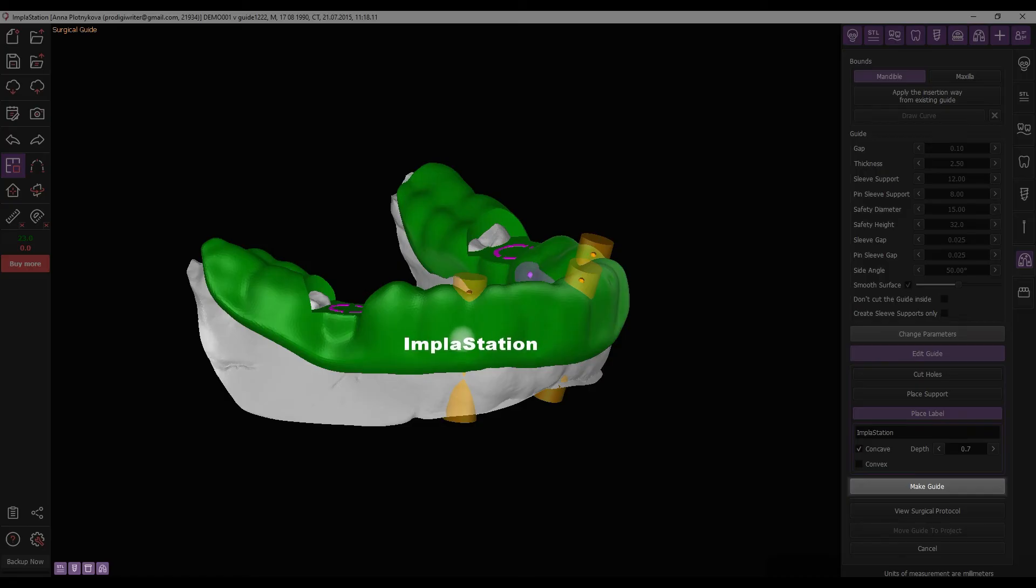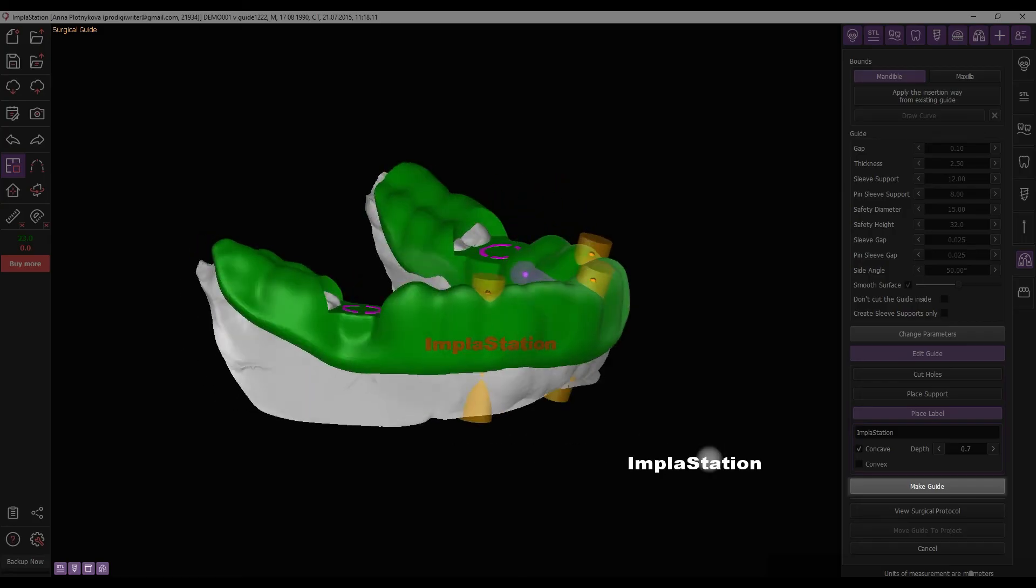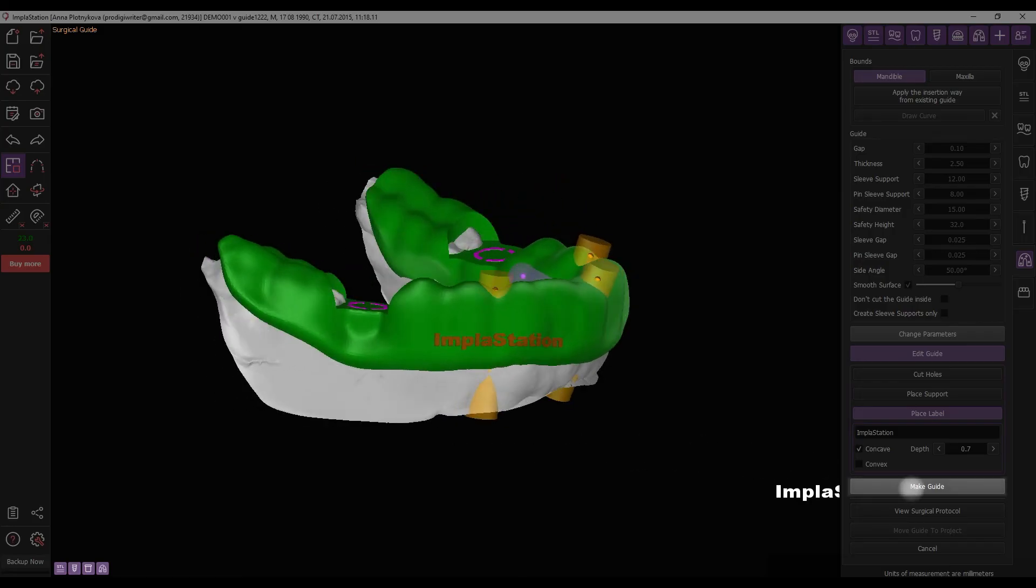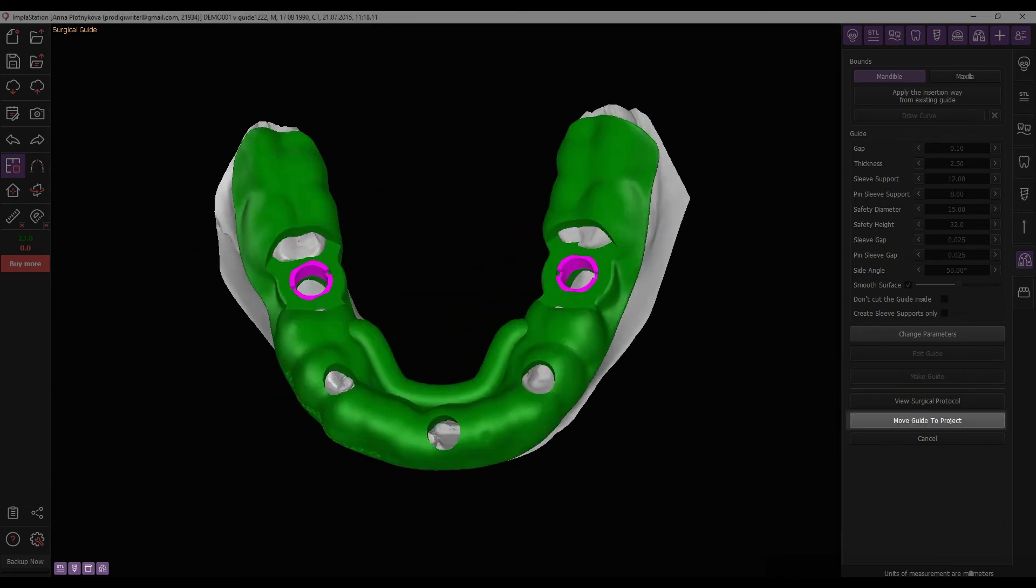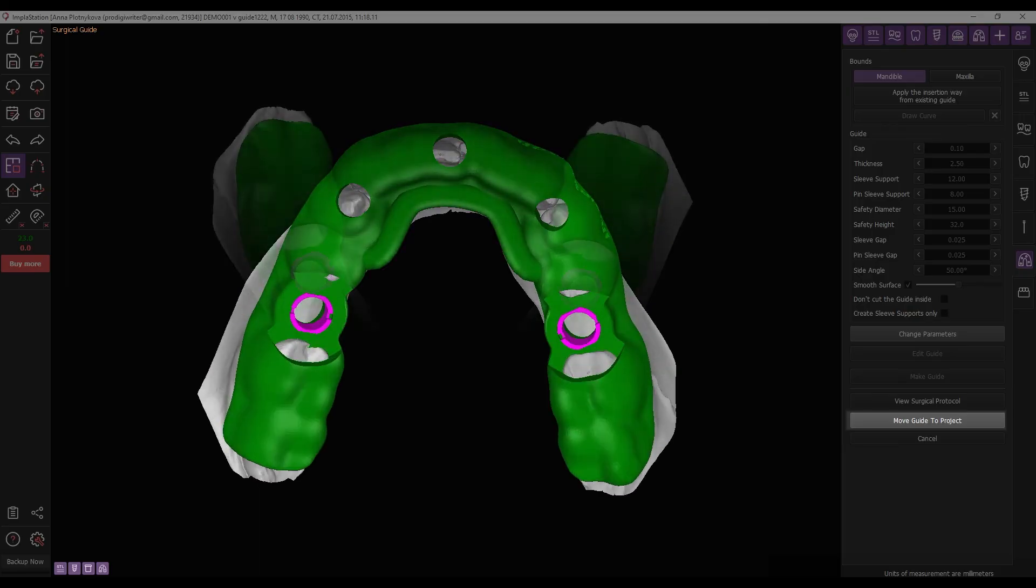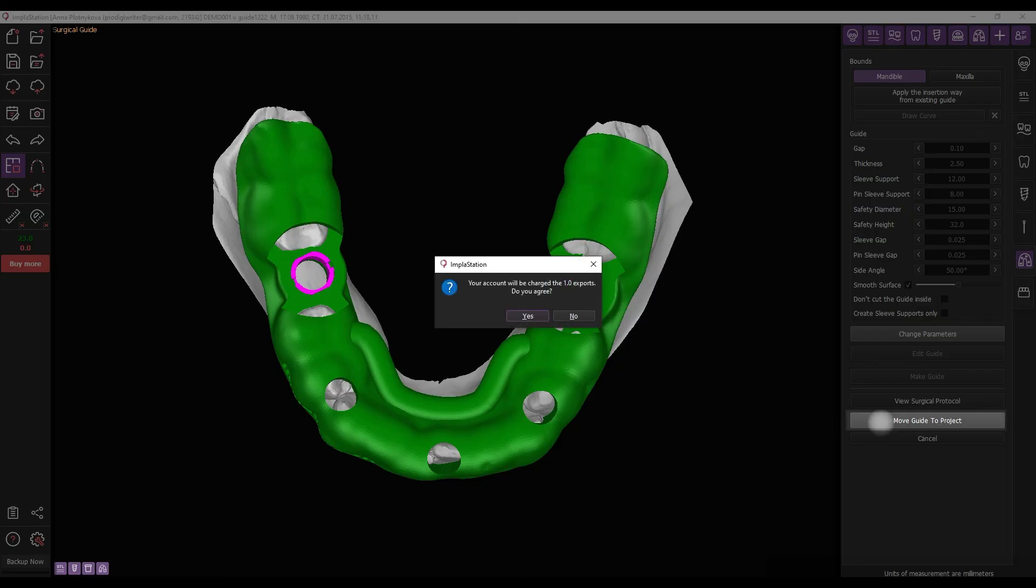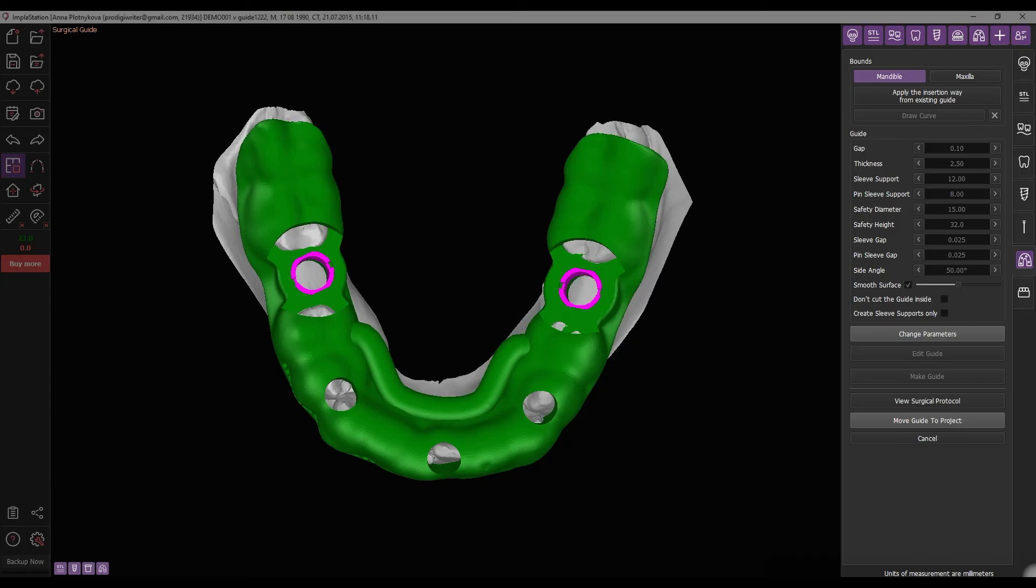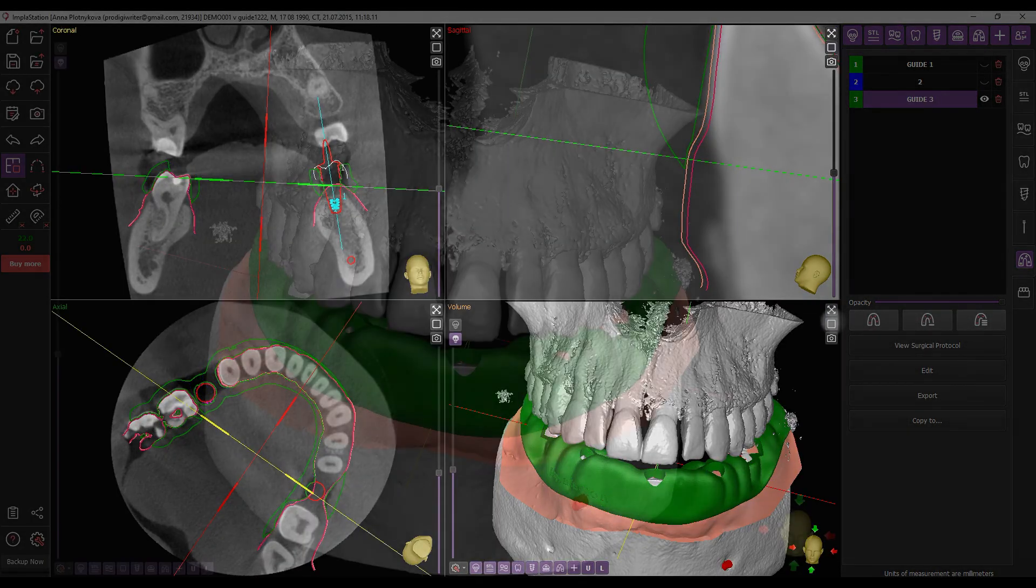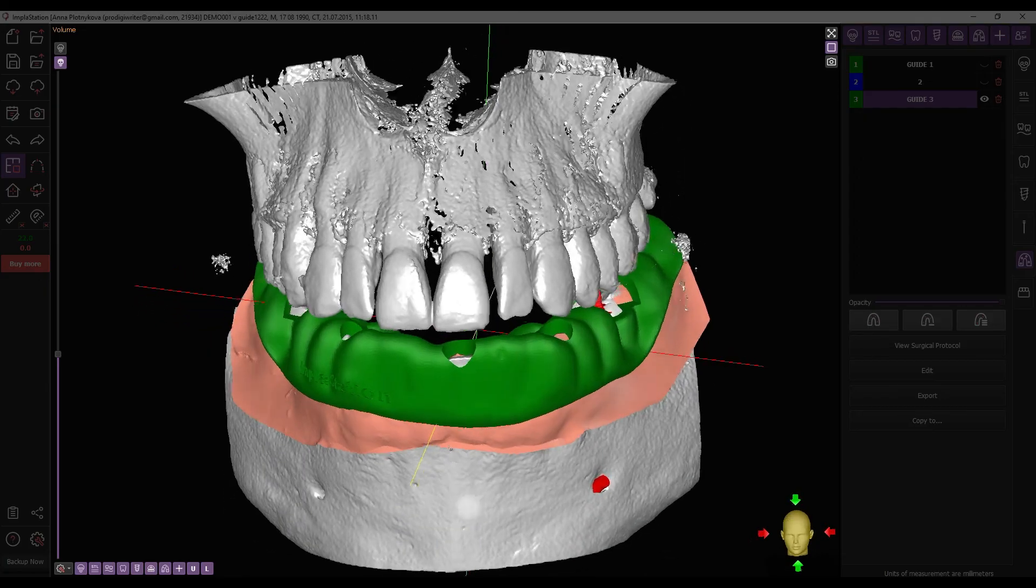You can still make edits to the guide even after it has been created. Complete the process by clicking Make Guide. If the guide meets your needs, you can transfer it to your project. Please note that it is a paid feature and one export will be deducted for its use. The guide has been successfully integrated into the project.